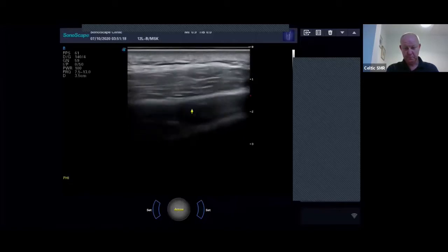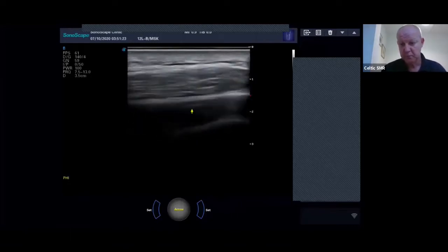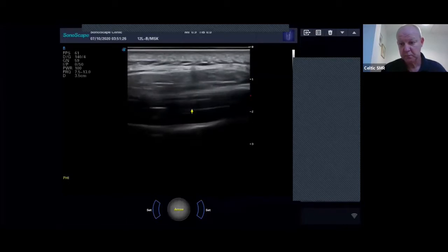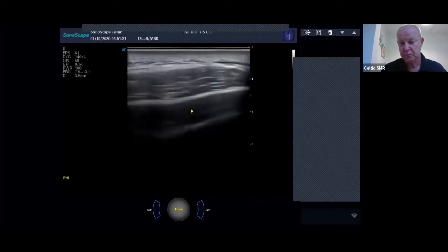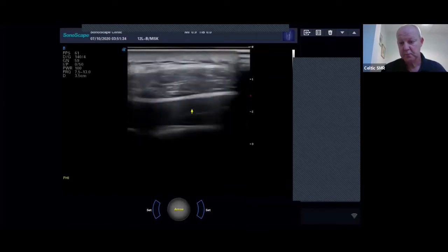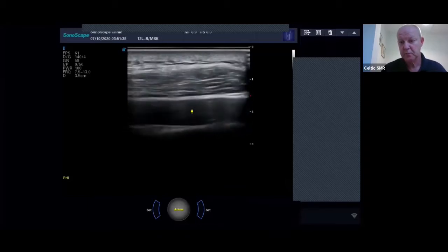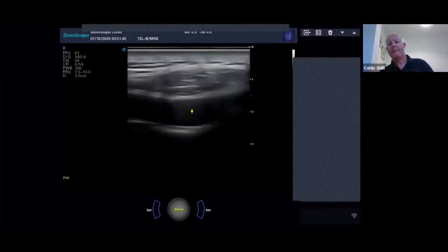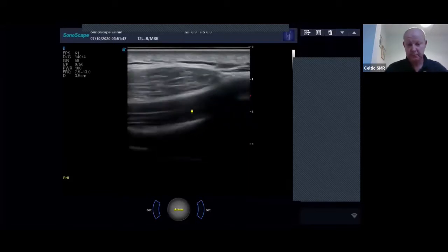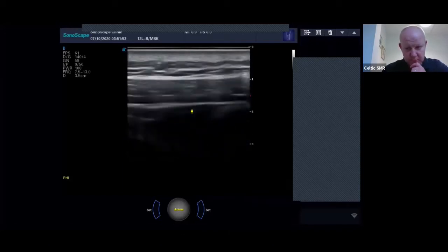And then, as long as you're not ticking any of those boxes, then you can probably say that it's probably a lipoma. But the other thing is just to say that if you get any rapid growth with it, then you should have another scan. If it becomes tender or painful, get another scan. And if it's quite large as well, I'd probably get another scan, or even refer in if it's 6-7 centimeters, I think they're quite prone to wanting to take those out when they get to that sort of size. So I think that pretty much covers it.